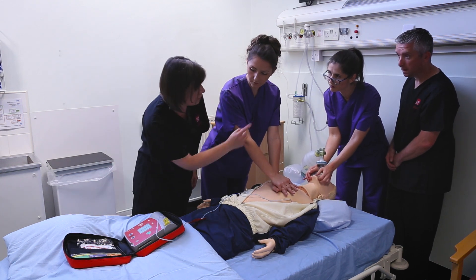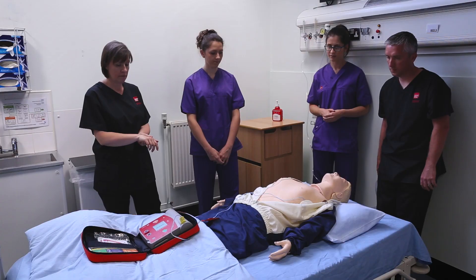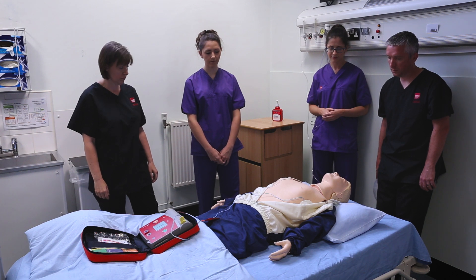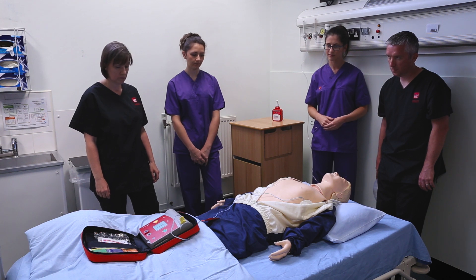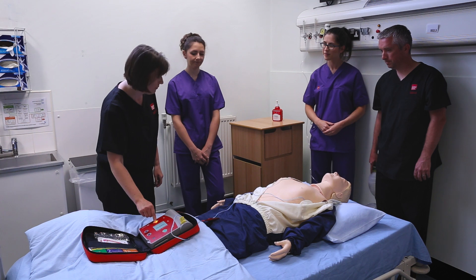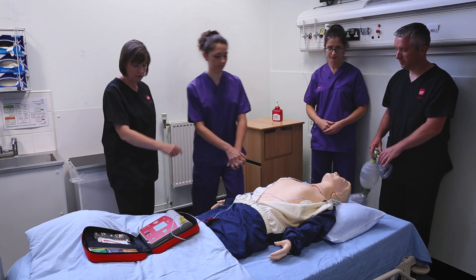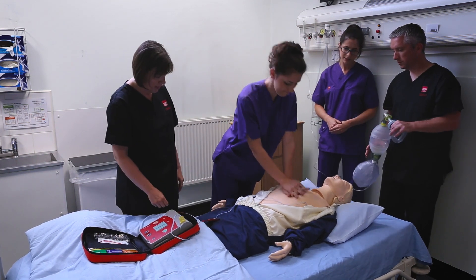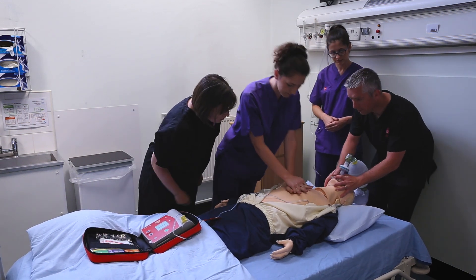Should we do 30 compressions with two breaths and then put the defib on. Shock advised. Charging. Stay clear of patient. Deliver shock now — everyone clear? After the shock, interlock one hand on top of the other. Your hand is located about a third of the way down the chest.